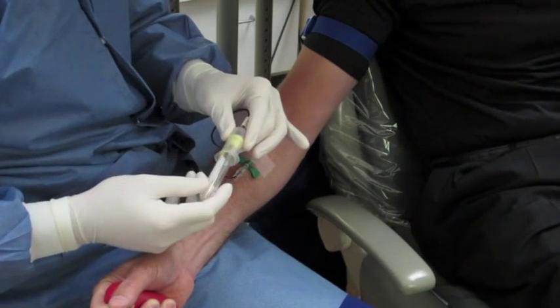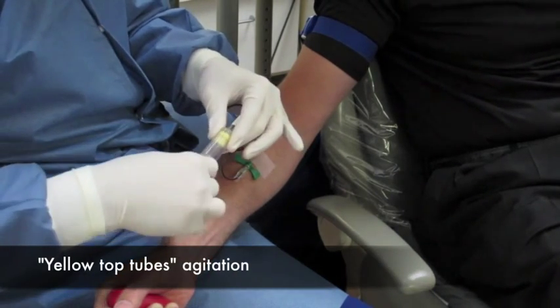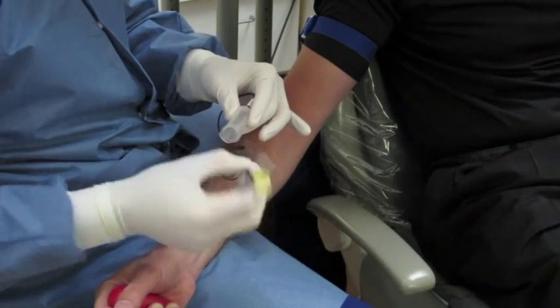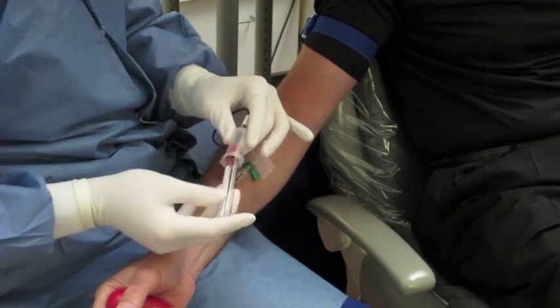Draw the blood, starting with the yellow tops first because they have an anticoagulant inside the tube so they won't clot the red blood cells. Be sure to agitate the tube eight times so that the anticoagulant — sodium citrate — will be incorporated into the blood.